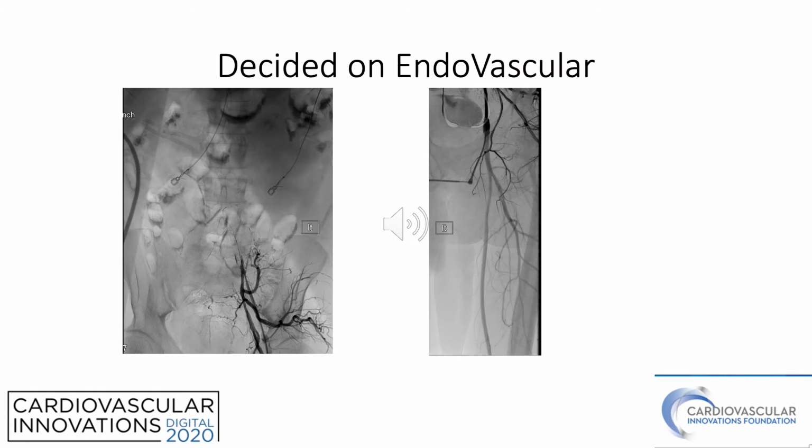We gained ultrasound guided access into the left common femoral artery, and then took angiography of the runoff, which confirmed the CTA that there was no significant disease beyond the aortoiliac occlusion.